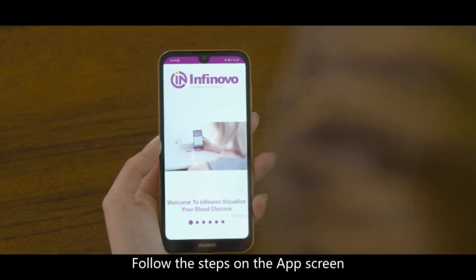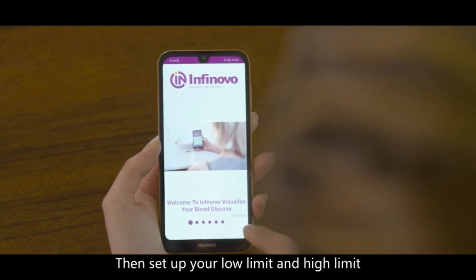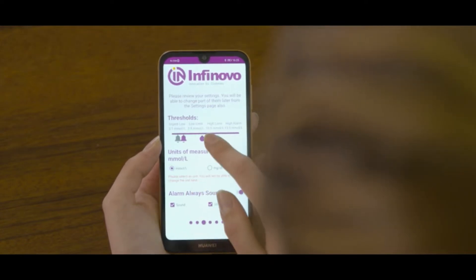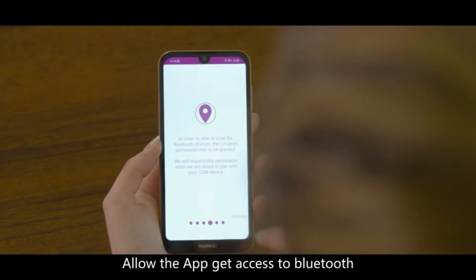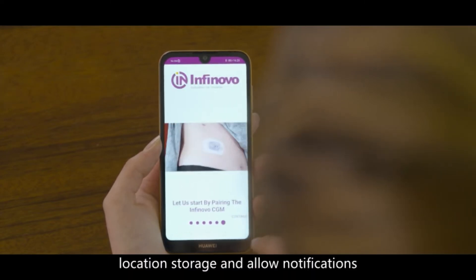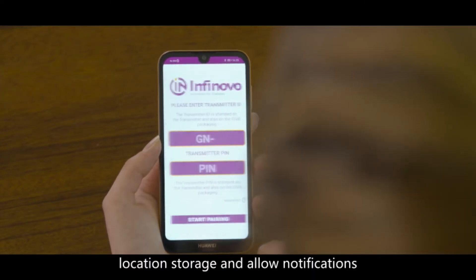Follow the steps on the app screen. Then set up your low limit and high limit. Allow the app to get access to Bluetooth, location, storage, and allow notifications.